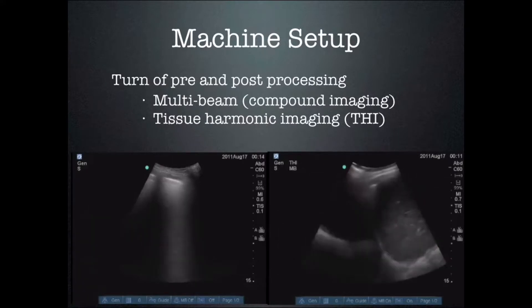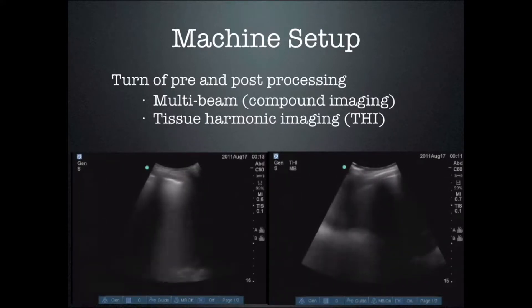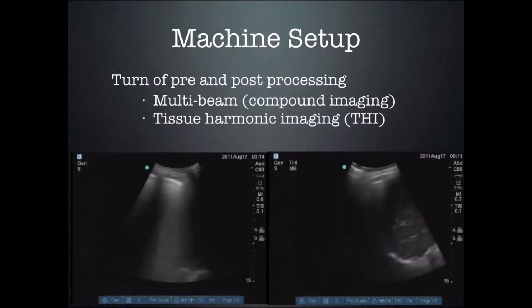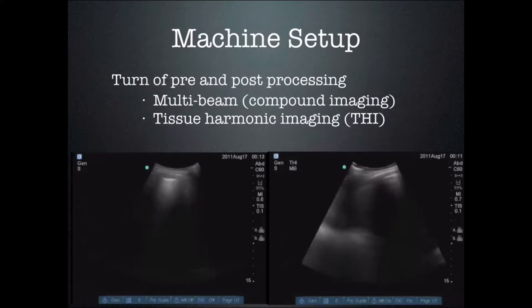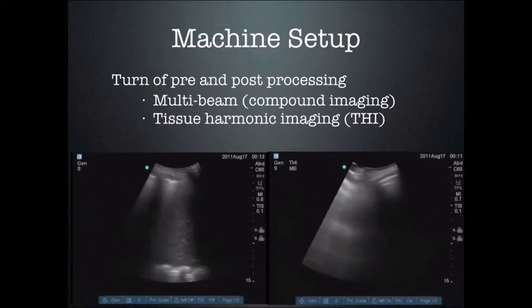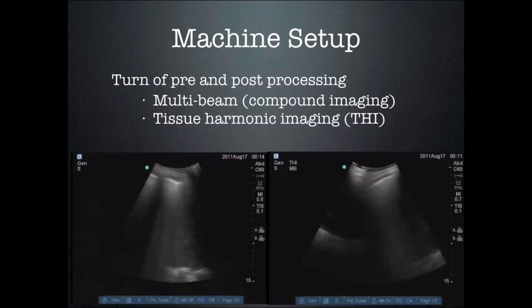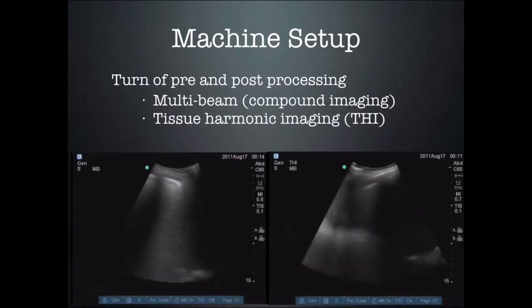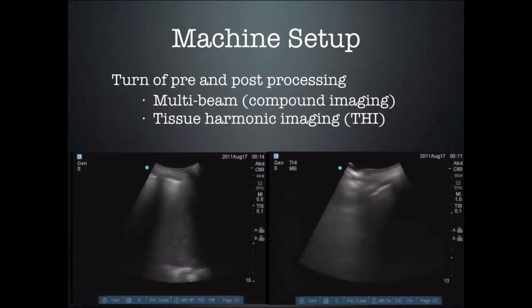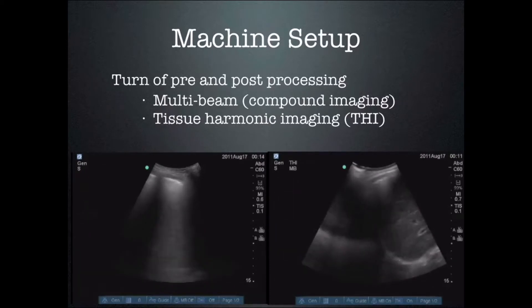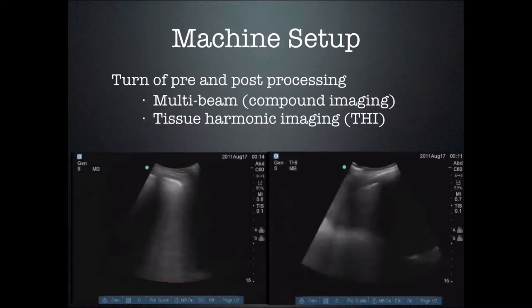Every once in a while we see one that comes off the screen, but it is a little more difficult to see. That is because the image on the right has multi-beam or compound imaging turned on as well as tissue harmonic imaging. Both of these modes decrease the amount of artifacts seen after the image has been displayed. So if you want the classic appearance of lung rockets you may have to turn off multi-beam or compound imaging as well as tissue harmonic imaging.